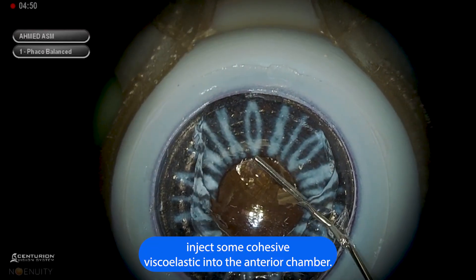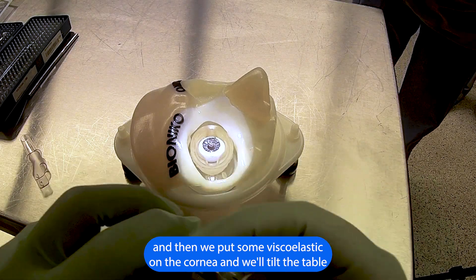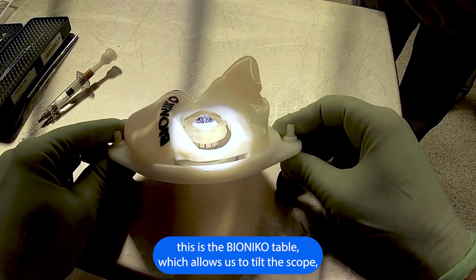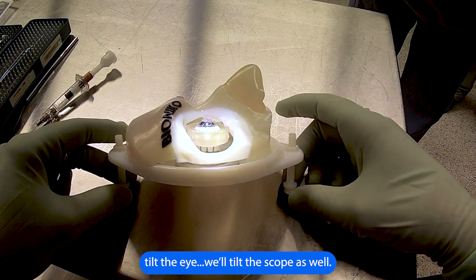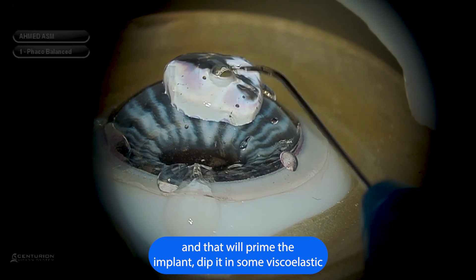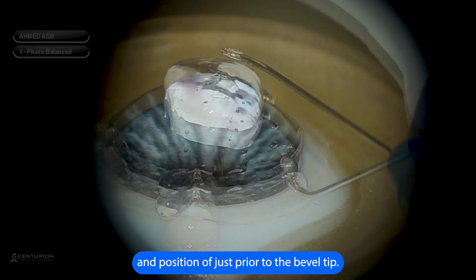We inject some cohesive viscoelastic into the anterior chamber, then put some viscoelastic on the cornea and tilt the table. This is the BIONIKO table which allows us to tilt the scope and tilt the eye. We'll tilt the scope as well, and that will prime the implant — dip it into some viscoelastic and position it just prior to the bevel tip.